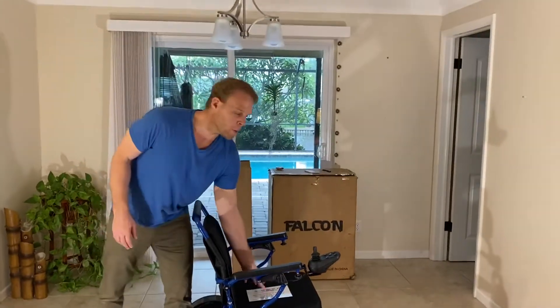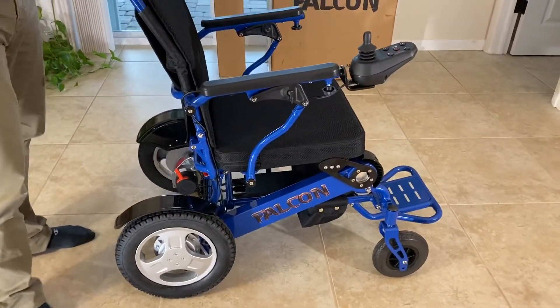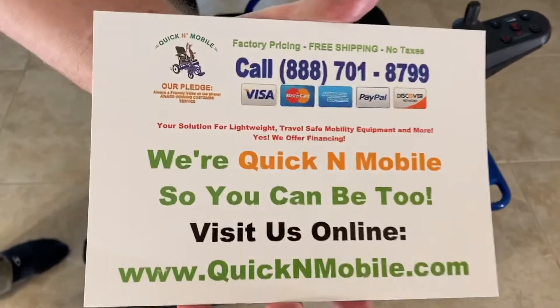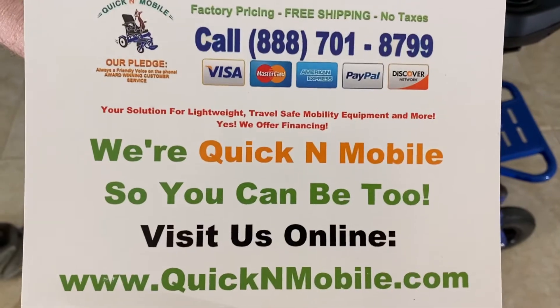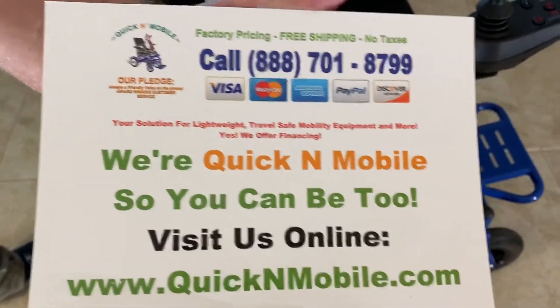Hi, this is Paul from Quick N Mobile and I am here with a Falcon reclining power lightweight folding FAA travel approved wheelchair. We're going to show you how the reclining mechanism works. This may be a great opportunity to pause the video and write down how to find this online for more information.